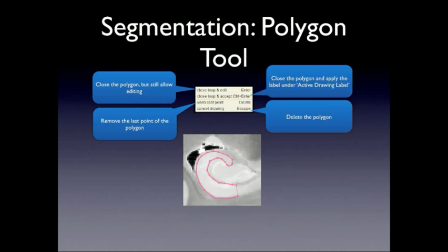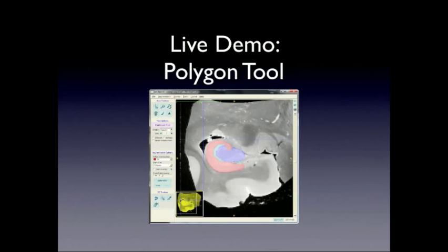So the first tool I'm going to talk about is the polygon tool. And this is generally, when I do segmentation, this is what I use to cover large areas and do them pretty quickly. So as you can see in this little image, and I'll show in the demo, you can just use your mouse to draw along and trace out an area and fill that in. And it just has this little four option command thing. And I think the best way is to just show this with the live demo. So I'll leave this slide up. This is what the final segmentation is going to look like. The blue area here is the dentate gyrus. The red area is the CA wrapping around it. And this light blue is the SRLM in between them. It's the white matter in between the two structures.